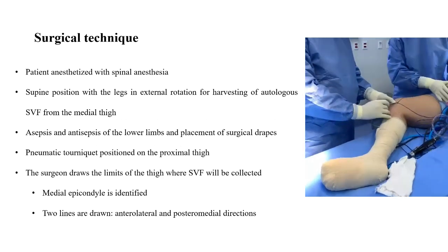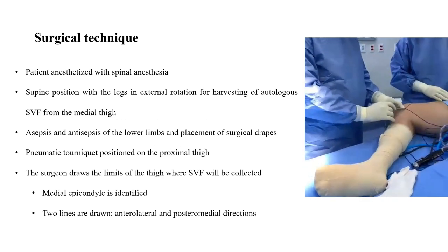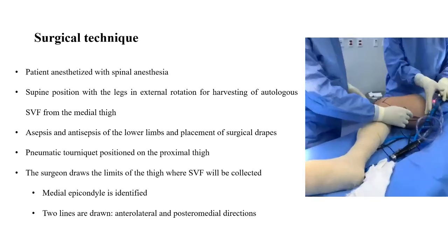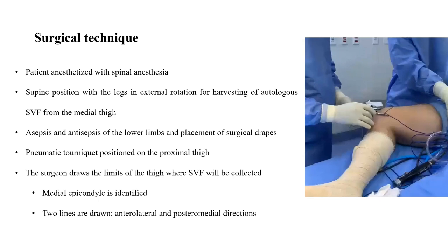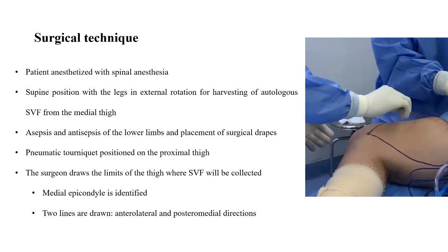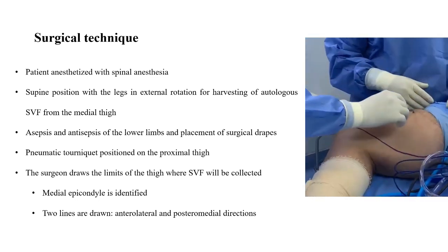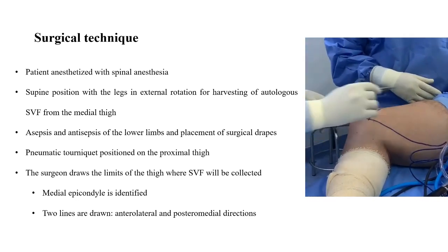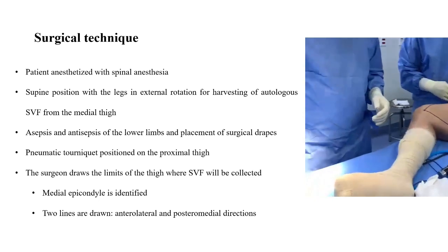The surgical technique begins with the patient anesthetized with spinal anesthesia. The patient is positioned in the supine position with the legs in external rotation for harvesting of autologous stromovascular fraction from the medial thigh. Asepsis and antisepsis of the lower limbs and placement of the surgical drapes is performed. Then, the pneumatic tourniquet is positioned on the proximal thigh.